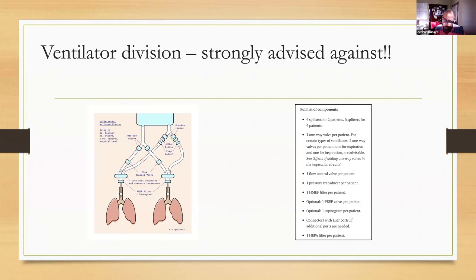Especially in the Ethiopian setting, where alarms and so on are concerning, I imagine that when physicians are not there, the nurses may not understand what it is. I would say that's a safe mode, and that's the mode I think everyone is probably using. So the mode you have to use is volume assist control. And sorry, remind me of the third question.